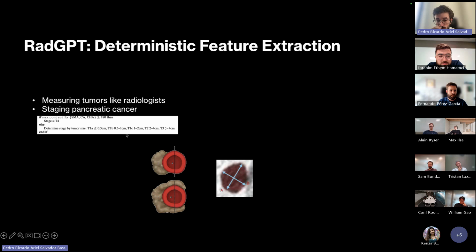These three important blood vessels. And what we do is we have an algorithm that walks through the vessel, and at each point, it finds the perpendicular plane, and it measures how much of the blood vessel border in that plane touches the tumor. And using that, it calculates the degree of contact.